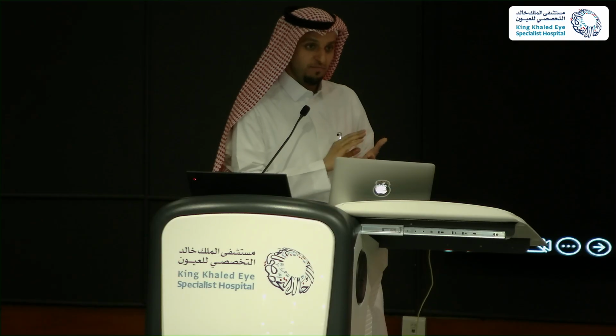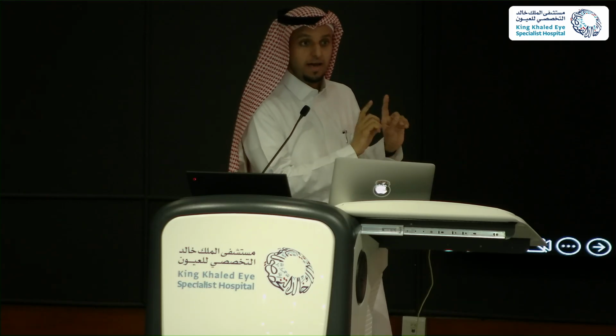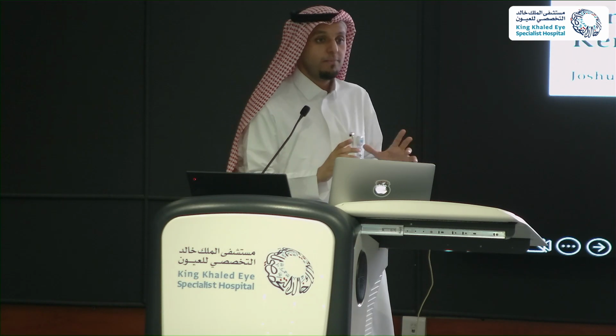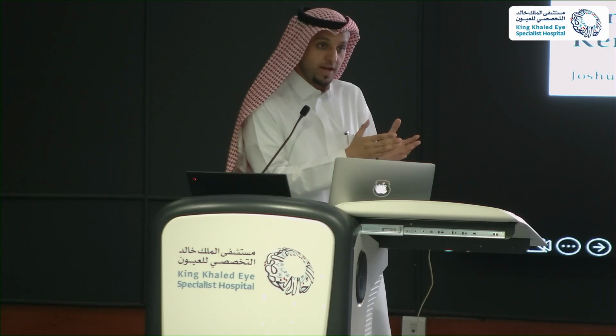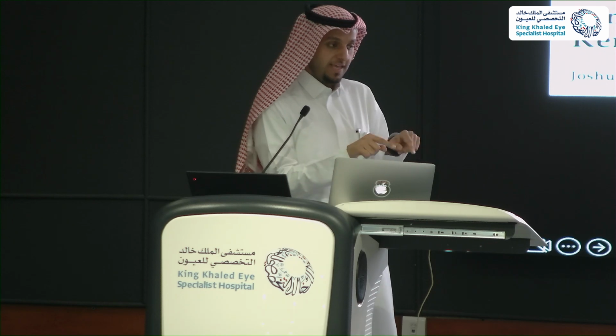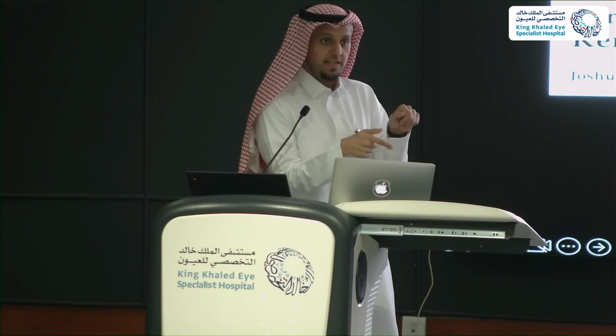If you allow me to comment, I would say thank you so much for your comments. They are very valid. They are enriching the lecture. All the problems that you've mentioned with big bubble DALK can be tackled with mushroom keratoplasty. Let's start with the diameter. When you're going into a diameter with a mushroom shape DALK, nowadays Joe told me that he's going up to 8.75 and 9. However, you're cutting deep. Your intrastromal tunnel is very deep to the DM.